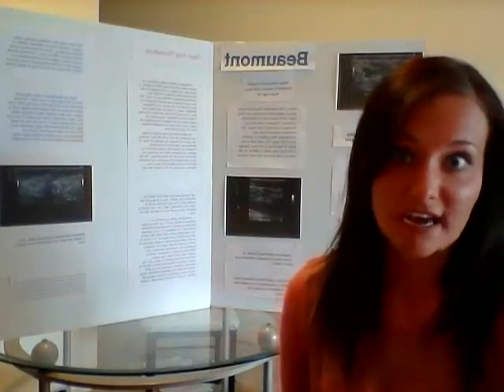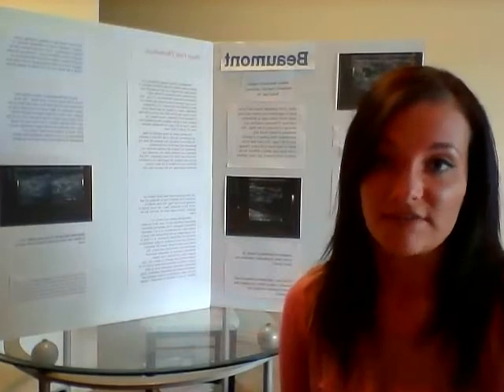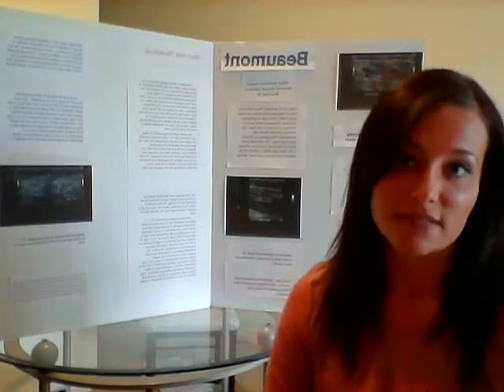But I thought this was a very interesting case, not only because I was a new student and I had found something that was really cool that you don't really see every day. You don't really see thrombus moving every day. You just see stagnant thrombus.